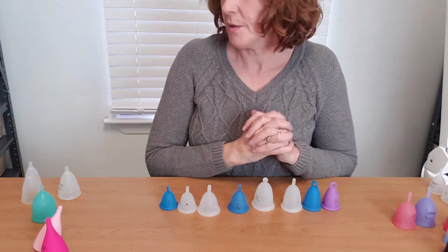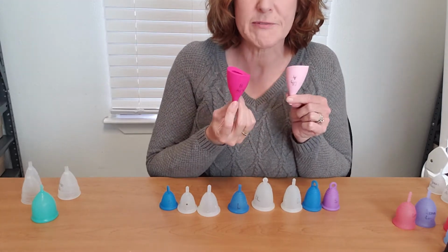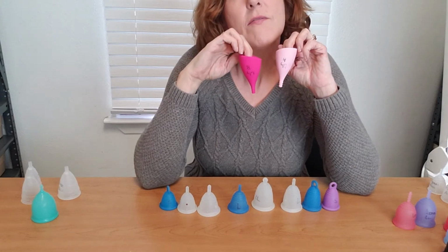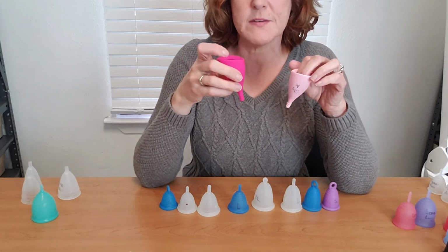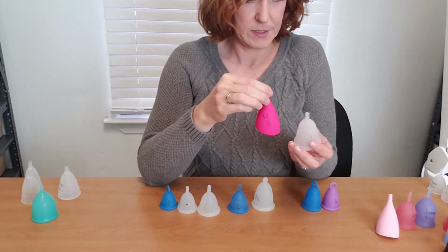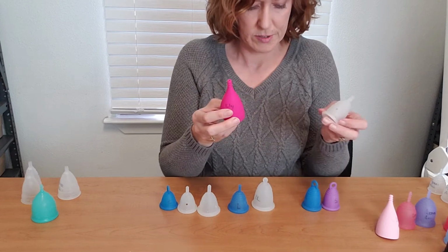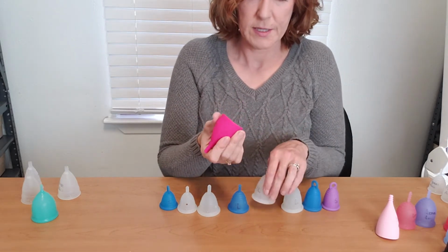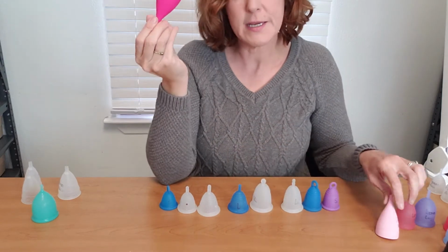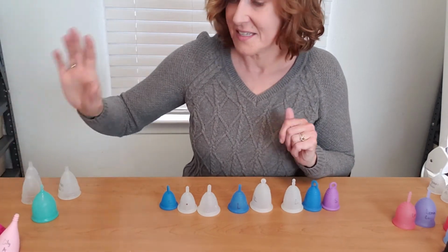Then there are other cups on the market that we don't hear so much about. The Lily cup, of course, is so obviously super long that it probably appeals from the start to people that are looking for a very, very tall cup, because you can see even in the packaging that they're going to be very long cups. This is the larger of the lilies, and you can see it's quite a bit taller to our standards. And they're shaped differently, so it's hard to compare the diameter. If you have a lily and it's too long, certainly almost any cup will be shorter than the lily. And what else?